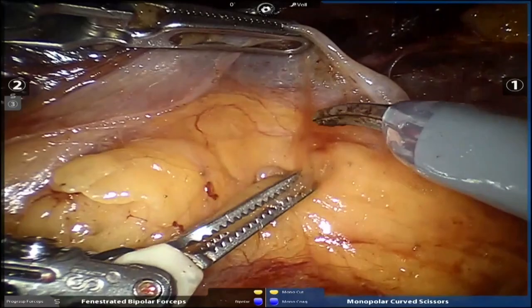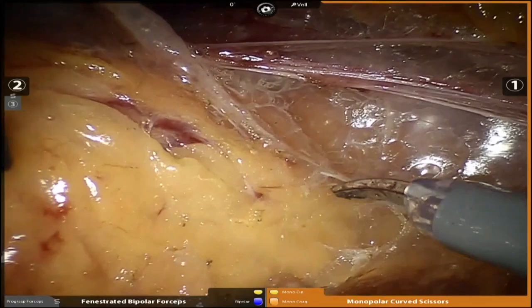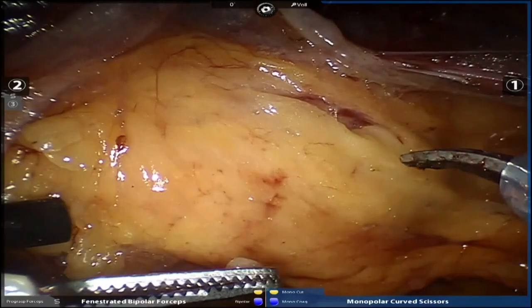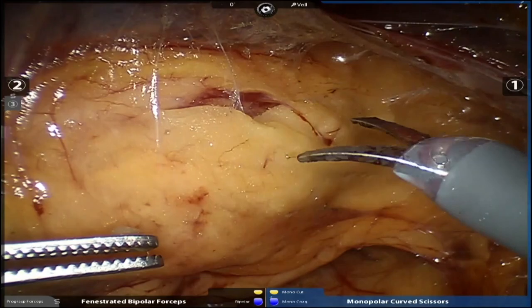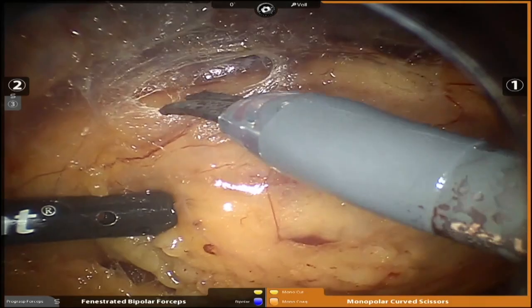So here's the cut edge of Gerota's fascia. Remember I told you about that cut edge? There it is. The key is to stay inside of that. If you stay inside that, then you're not going to get into the peritoneum. So it's another layer between you and the peritoneum. And if you stay out of the peritoneum, then you're going to like the operation better. So cut edge, just to show you again, there it is. This is tumor right here. It's a very large tumor. It encompasses pretty much the whole lower posterior portion of the kidney. So it's quite large. I mean, this tumor is probably 6 centimeters.